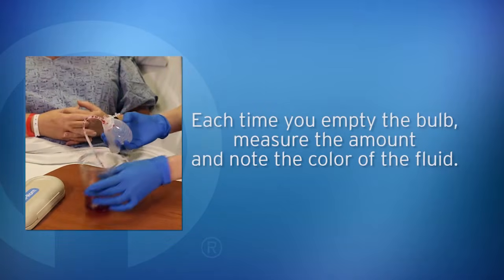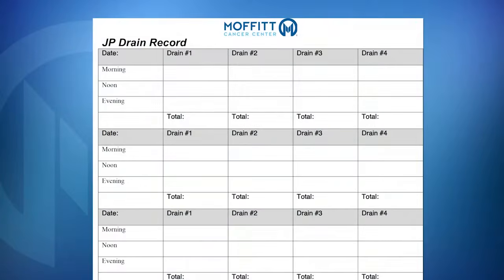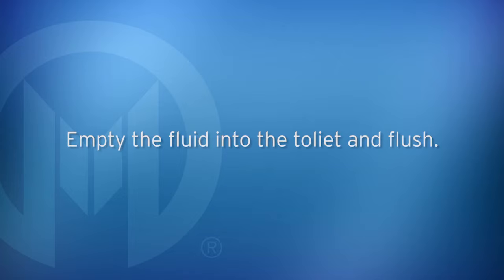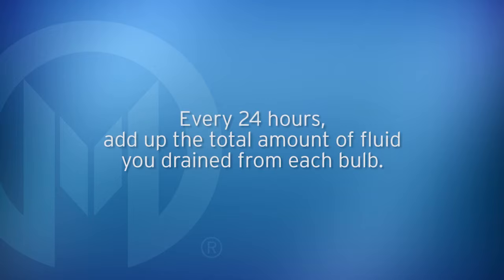Each time you empty the bulb, measure the amount and note the color of the fluid. Write it on the JP drain record sheet that you will be given before discharge. If you have more than one drain, keep a separate record for each one. Empty the fluid into the toilet and flush. Rinse your measuring cup and wash your hands with soap and water. Every 24 hours, add up the total amount of fluid you drain from each bulb.